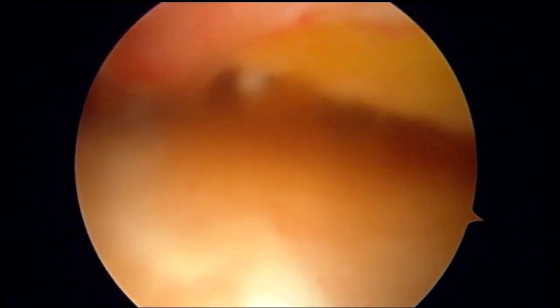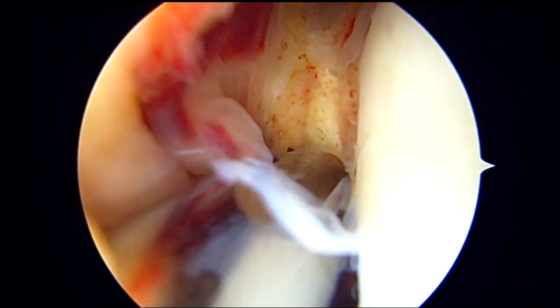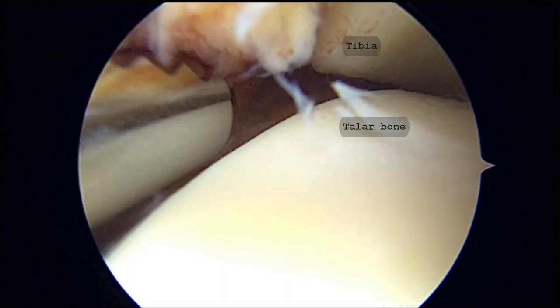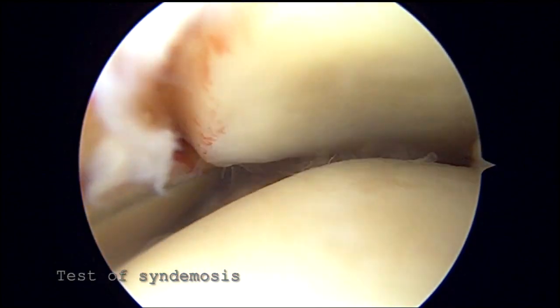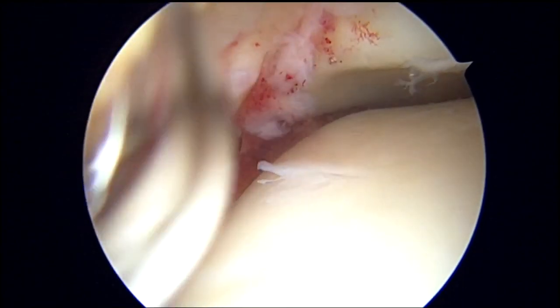A 3.5 mm soft tissue shaver is used to clear out the hematoma before joint evaluation. The shaver is pointed toward the fibula as we localize the tibiofibular recess for evaluation of the injury. The syndesmosis is tested by pushing the shaver towards the fibula, and there is a positive drive-through sign as the shaver easily enters the tibiofibular space as a sign of instability.